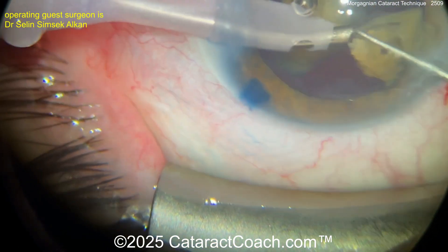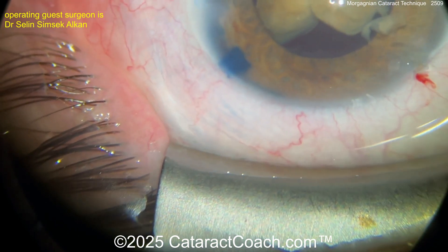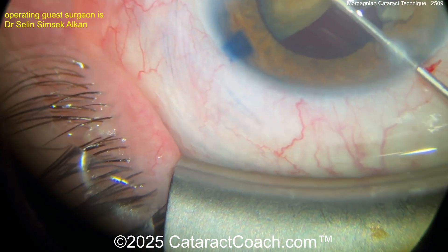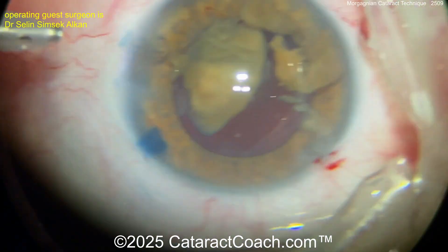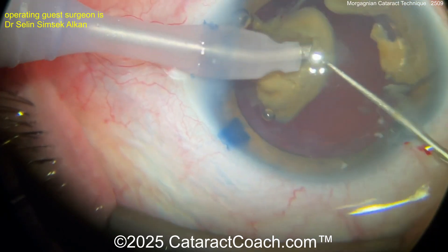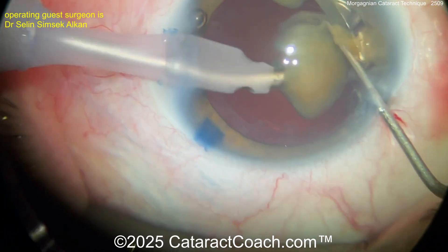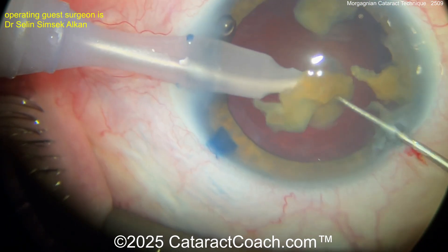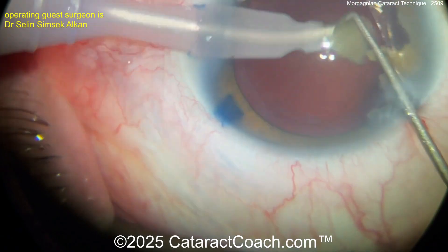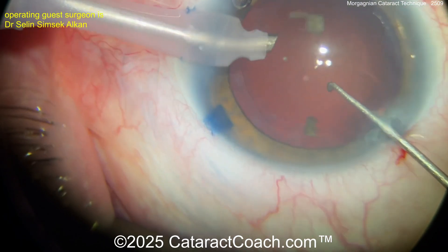What are you going to do for a lens here? These patients are going to be so happy with a monofocal lens. For lens calculations, obviously you can't use an optical method for axial length measurement — so you're going to have to use an A-scan. If the other eye can be measured optically, measure the other eye optically and then measure both eyes with ultrasound. If your A-scan measurement matches the optical measurement on the fellow eye, your technique and calibration are good and you can trust it. Worst case scenario — use the calcs of the other eye and maybe add a half or one diopter to the IOL power. A pinch of myopia is not a bad thing.